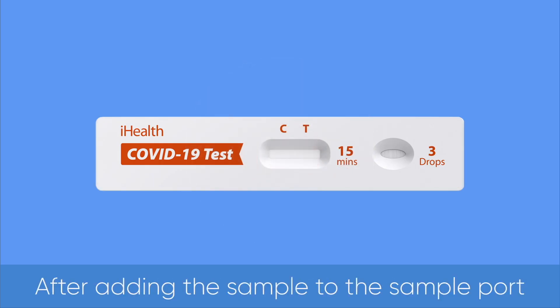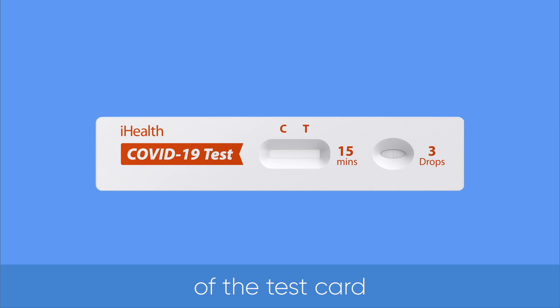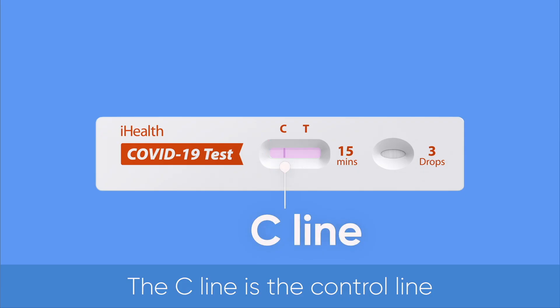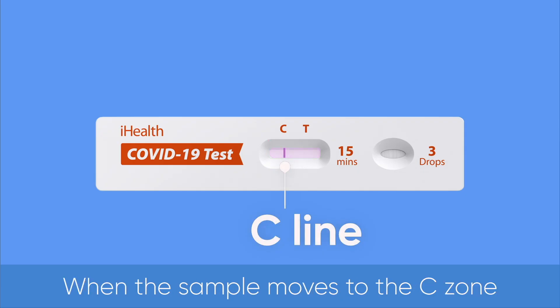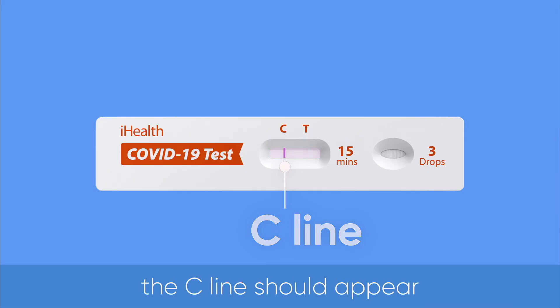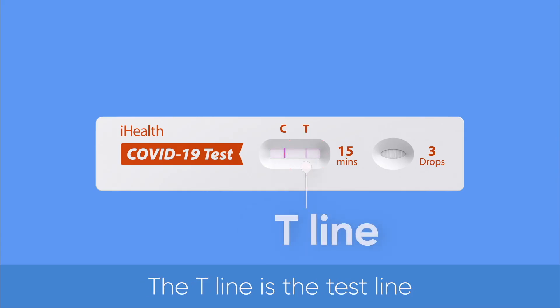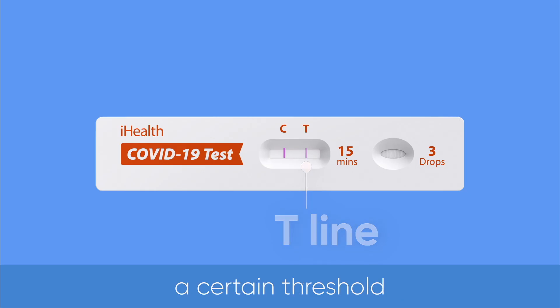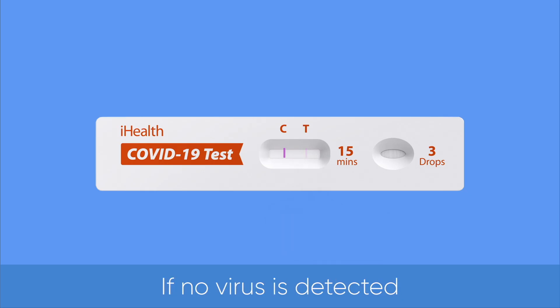After adding the sample to the sample port of the test card, the sample solution will automatically move across the result window. The C-line is the control line. When the sample moves to the C-zone in the result window, the C-line should appear. The T-line is the test line. It should appear if virus concentration reaches a certain threshold. If no virus is detected, the T-line will not appear.